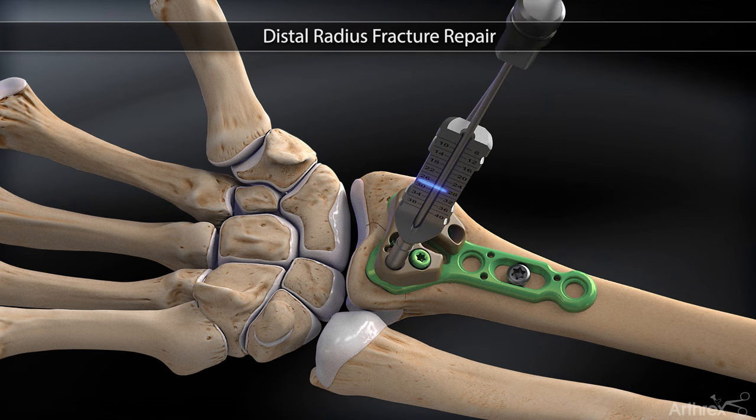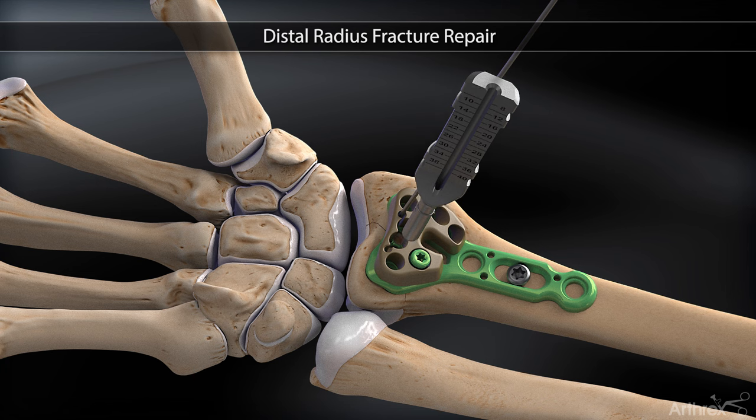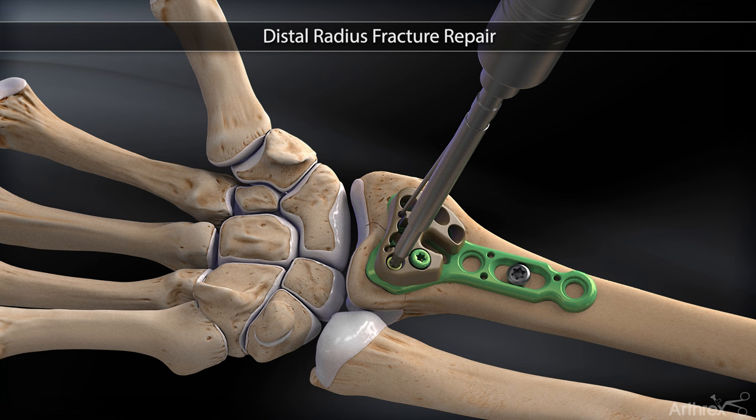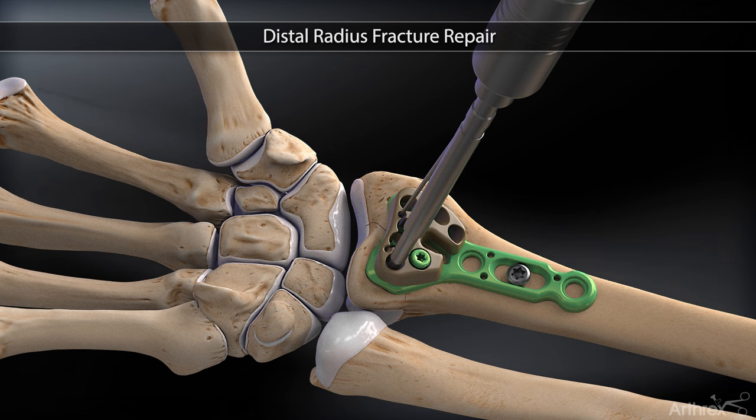The depth measurement can be read off the drill bit itself, or the depth probe can be used. A 2.4 millimeter locking, non-locking, or near cortex screw is inserted.